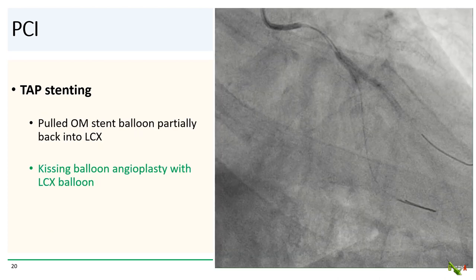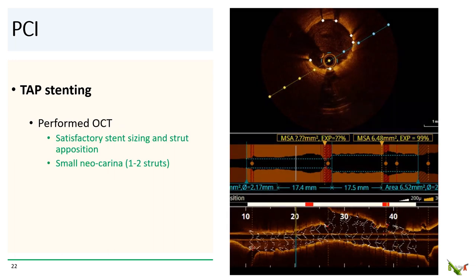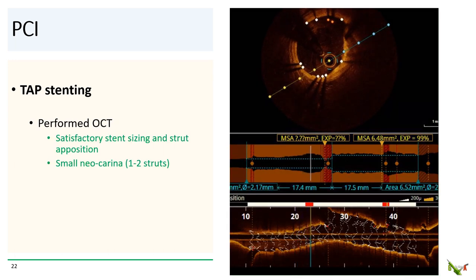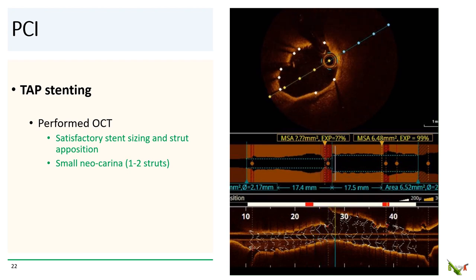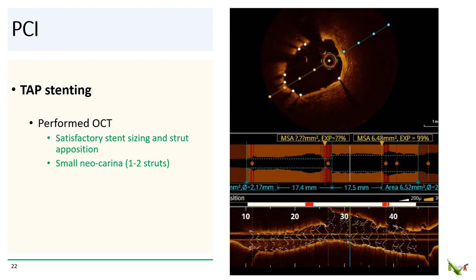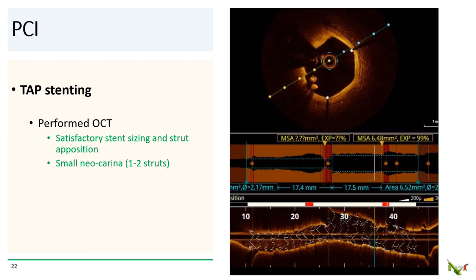Next, we pulled the OM stent delivery balloon partially back into the circ and performed kissing balloon angioplasty with the circ balloon. This step helps modify and optimize the angulation of the OM stent neocarina in the circ complex. After kissing balloon angioplasty, we did POT and ballooned the proximal circ. Finally, we did OCT of the circ — the stent was well sized and well opposed throughout. After the bifurcation, you can see a very small neocarina as expected, with only about one to two struts.